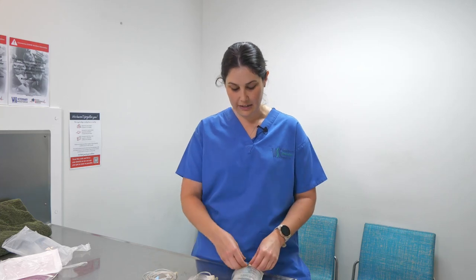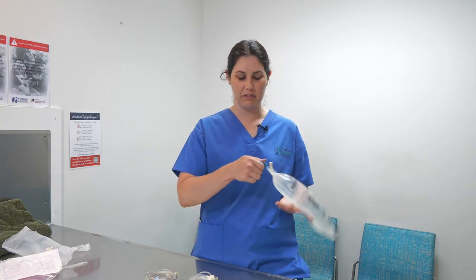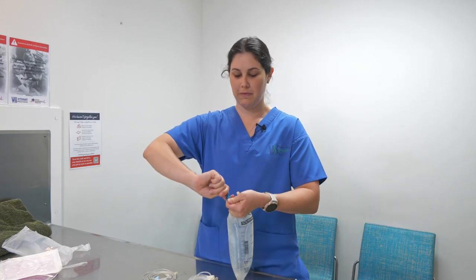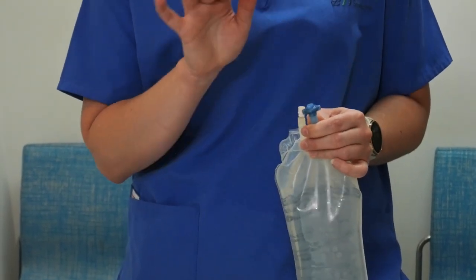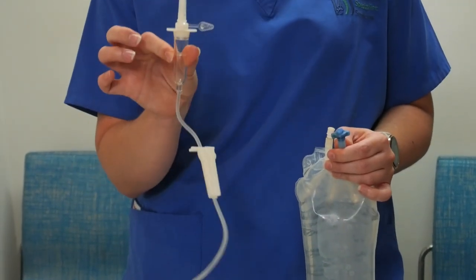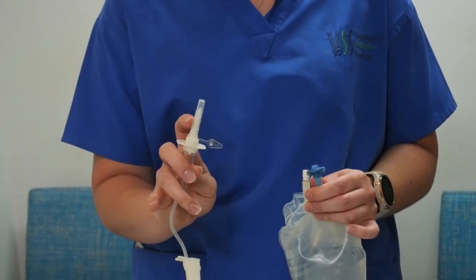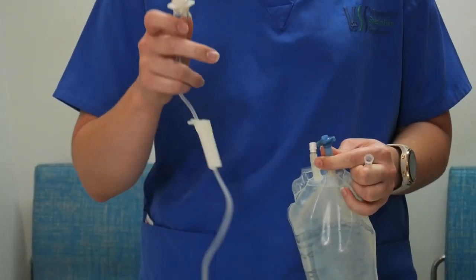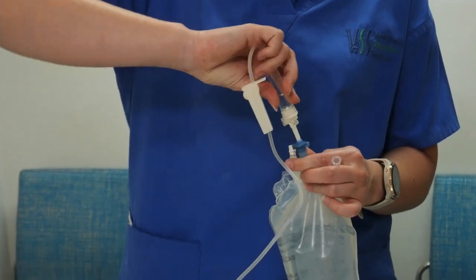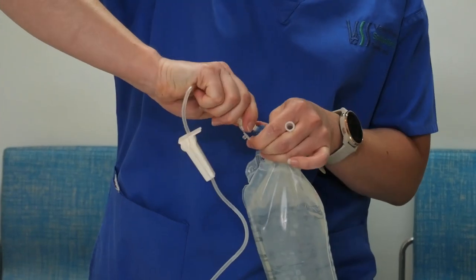Now we've got our three main things that we need. We're going to pull this one open just like that, and the bottom part of our blue tab we're going to pull off and twist. We want to keep this part nice and clean — we don't want to be touching that or putting it down on any surfaces. We're going to pick up the spiky end of our giving set, remove this cap — keeping it nice and sterile — and use our other hand to pull straight away from us. The spiky end is going to go into our blue tab, keeping it clean as we go, and we just give it a little gentle twist as we push in.